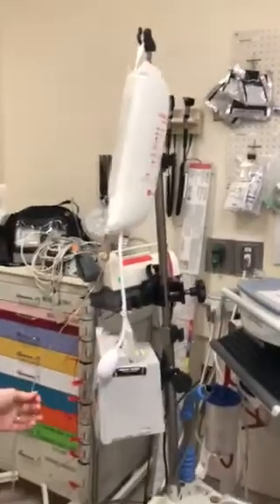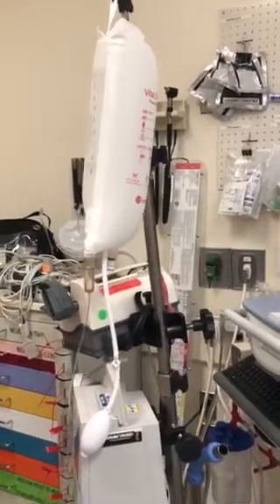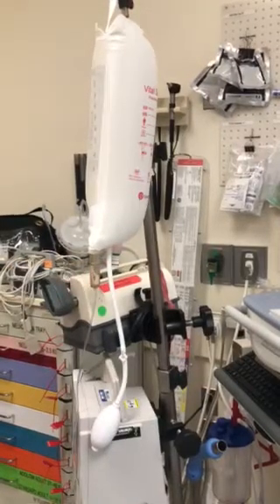Then I would open up my line and start infusing. As the bag of fluid loses volume, your bag is obviously going to need more pressure — you'll see it going down. You always want that gauge to be in the green.